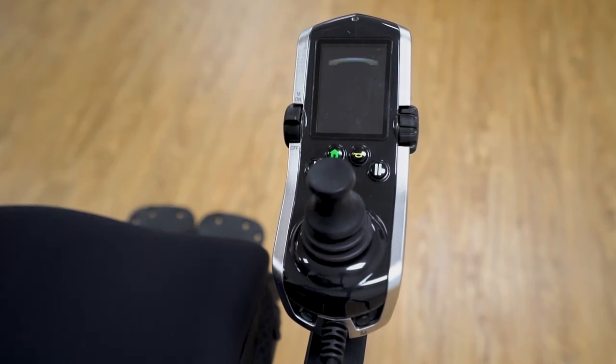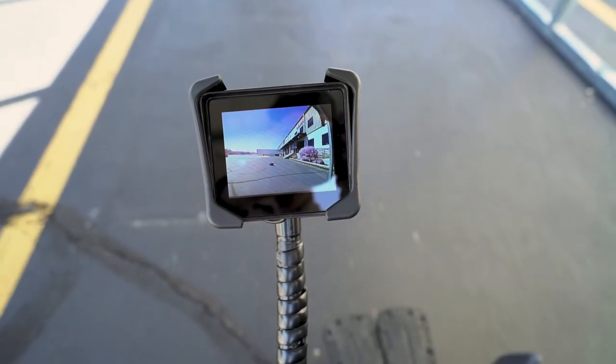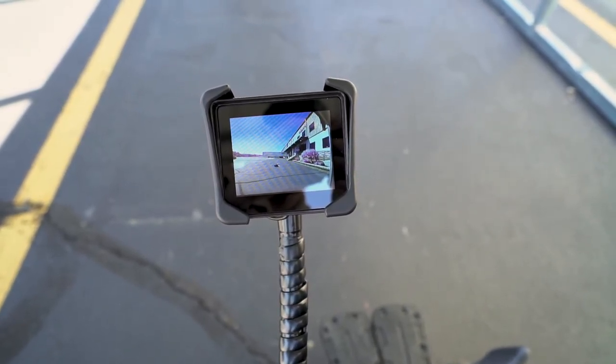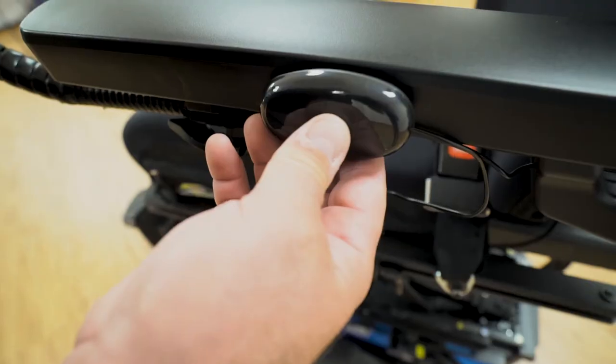Now for the final check, we will turn on the chair and make sure everything is working properly. By default, the backup camera will only be activated when the joystick is triggered in reverse. You can also set the display to be always on — to do this, press your egg switch.